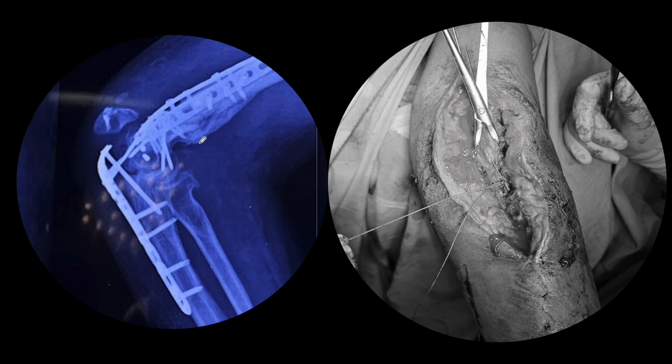Let's come to another case. This was a revision case in which you see the fragment is quite resorbed and has migrated proximally. This fragment belonged to the olecranon osteotomy done for distal humerus fixation. Here the osteotomy was probably done quite proximal, that's why the fragment appears to be small. Again the same issue — screw purchase in this small fragment is going to be suboptimal. So something extra needs to be done. Also this patient had developed a sore here and that's why this plate needed to be removed.